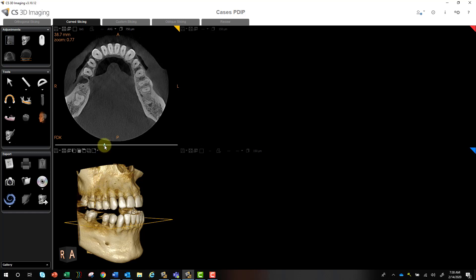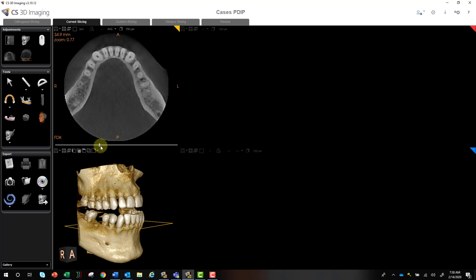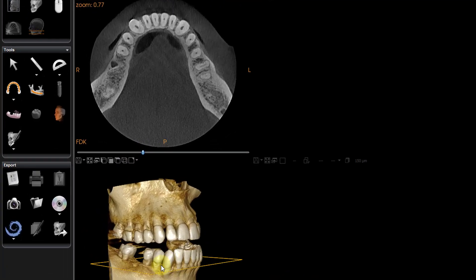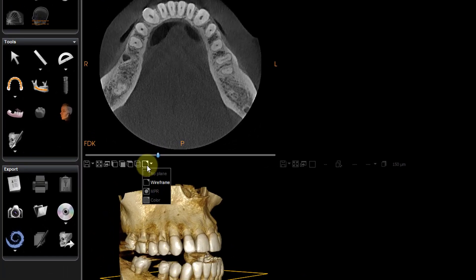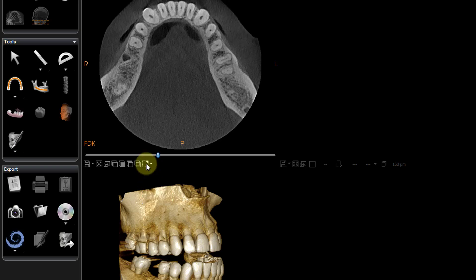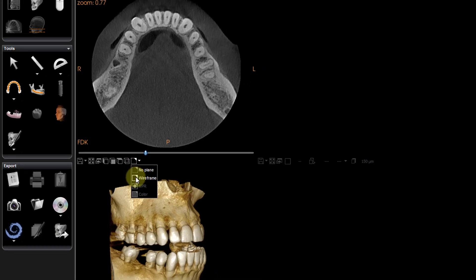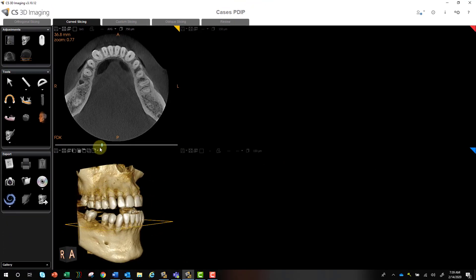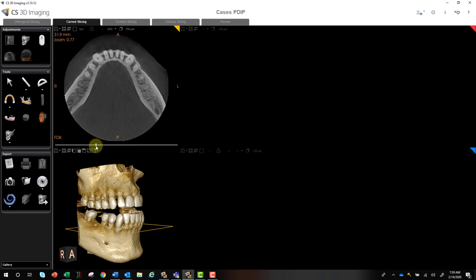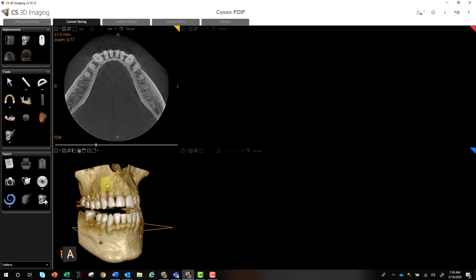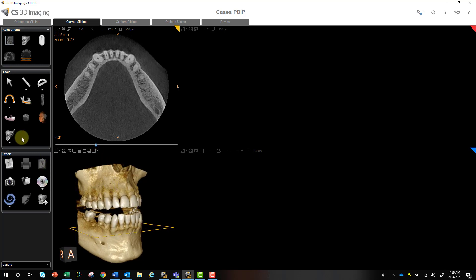You can see here we've got our axial slice — we can slide this up or down. If you don't see the yellow orientation bar, you can use this little feature here to turn this on and off. You want to map the arch that you're going to treatment plan, so here we're going to map out for the mandible.